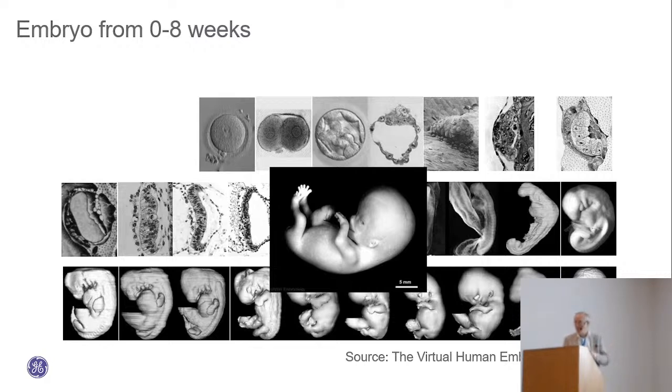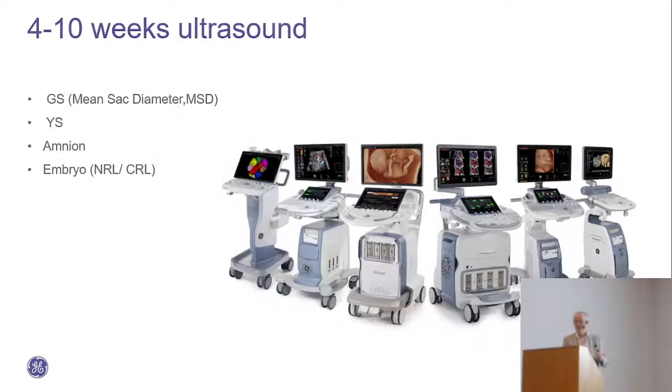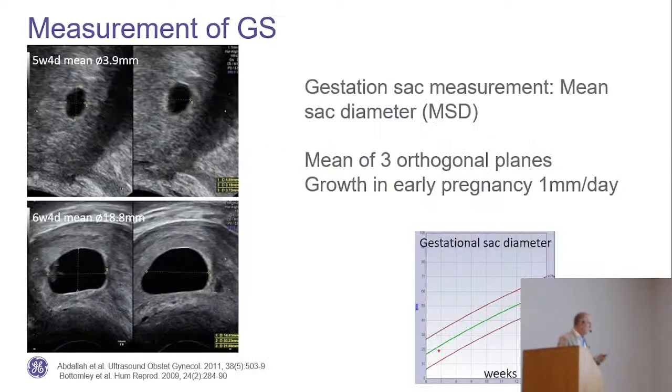And embryology in ultrasound also has a really big focus. I think you all know these beautiful images from Dr. Benoit. He's really a big fan of even going earlier than 12 weeks, and the images are really, really great. So that's what we would like to go. So let's have a look at the measurement of the gestational sac.